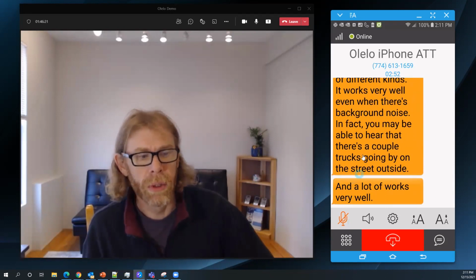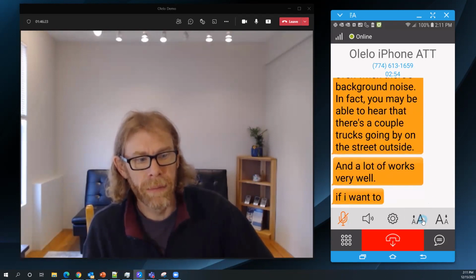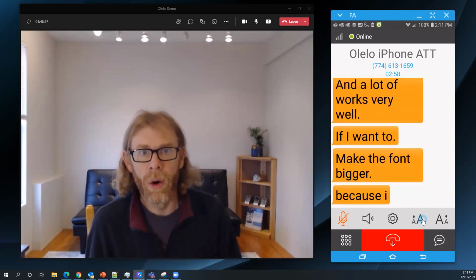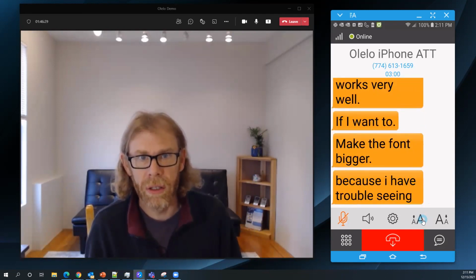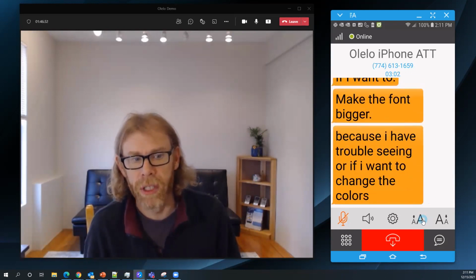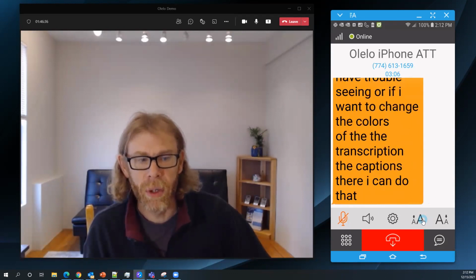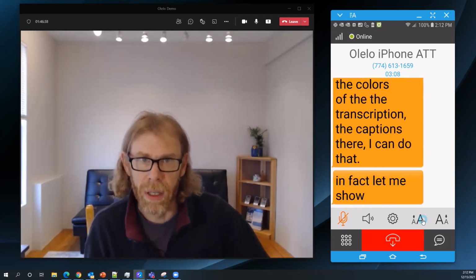If I want to make the font bigger because I have trouble seeing, or if I want to change the colors of the transcription, the captions there, I can do that. In fact, let me show you a better example. I'm going to hang up this call and make another.